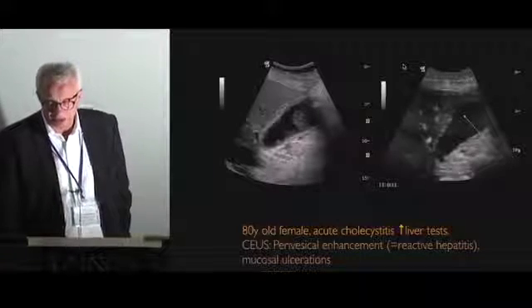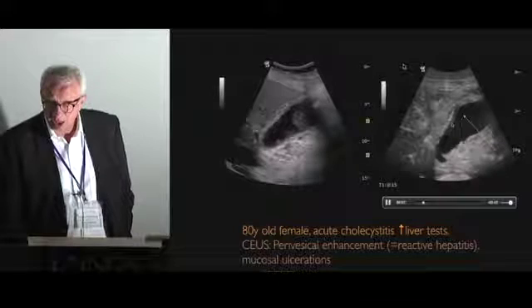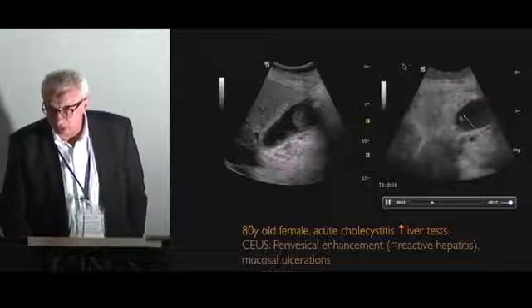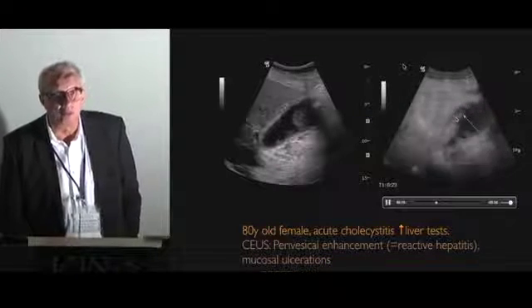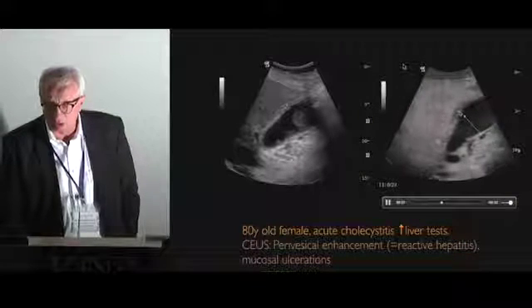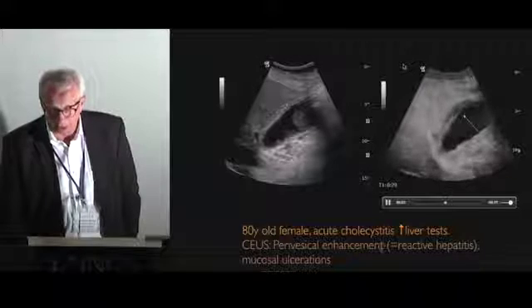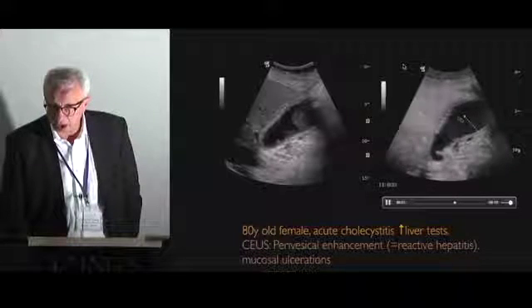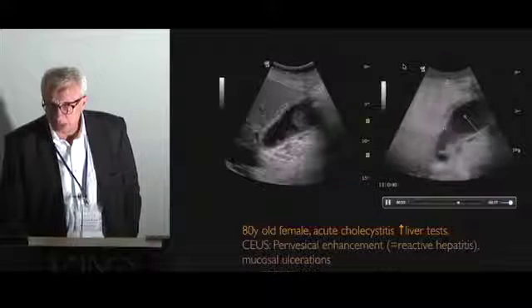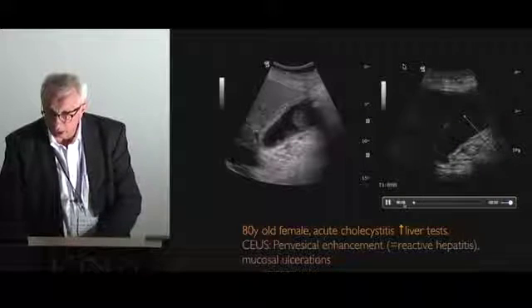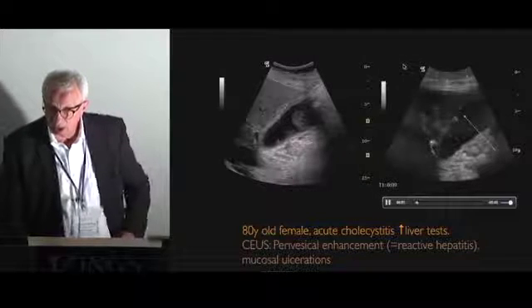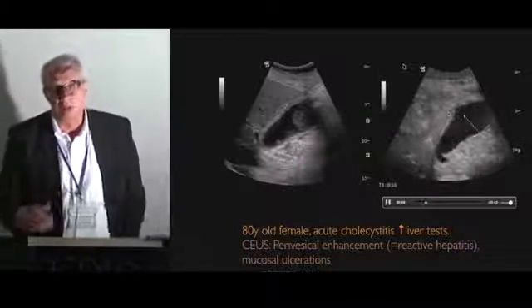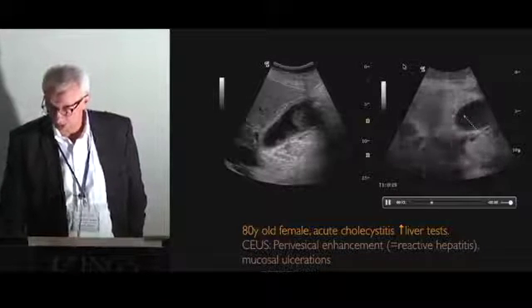This is another patient also with elevated liver tests. What you can see here are ulcerations of the wall. We can expect perforation if we do not perform treatment and cholecystectomy, because this is the first step to perforation of the gallbladder. When the contrast arrives, you can see the perivesical enhancement — the reactive hepatitis. This is one of the first things you can see when inflammation goes beyond the gallbladder wall.